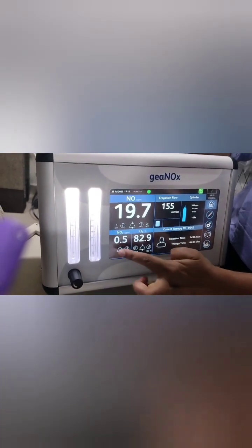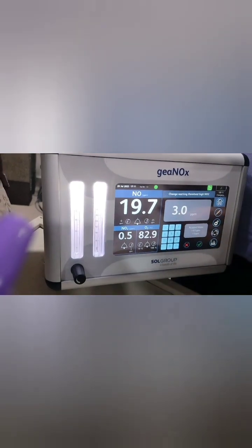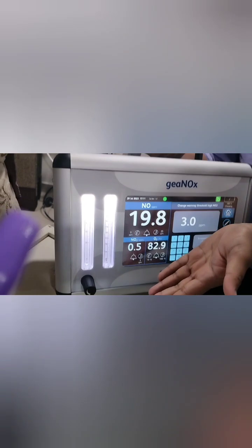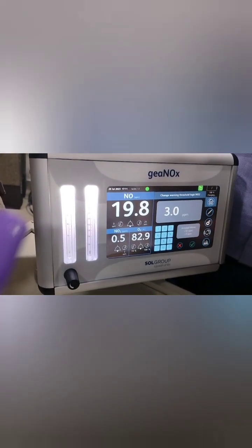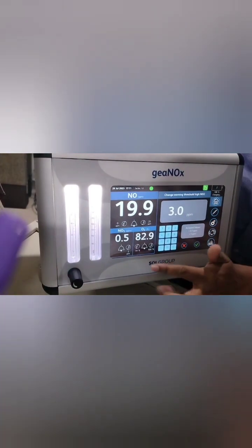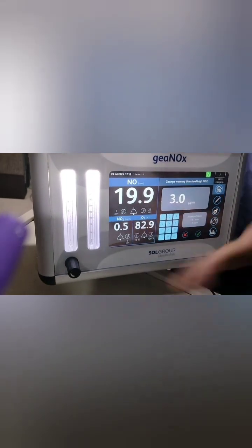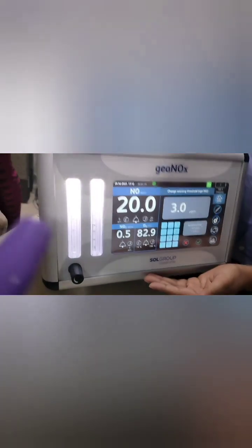Once you set 20 ppm, configure the NO2 alarm — traditionally keep it at 3. If NO2 exceeds 3, decrease the iNO dose by 50%; if it exceeds 5, stop the therapy immediately. There is also an oxygen sensor here — it independently reflects how much oxygen the baby is receiving.